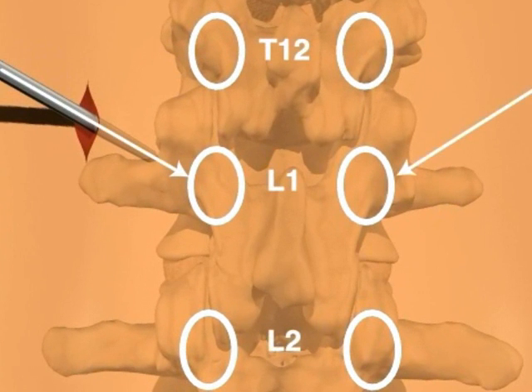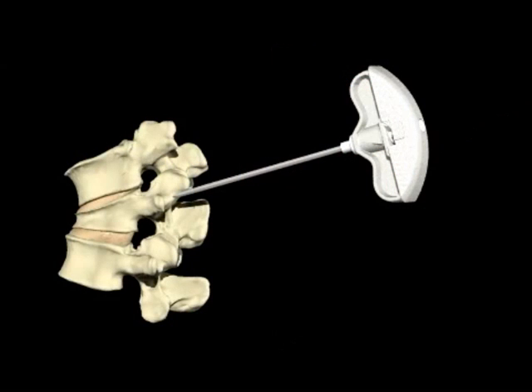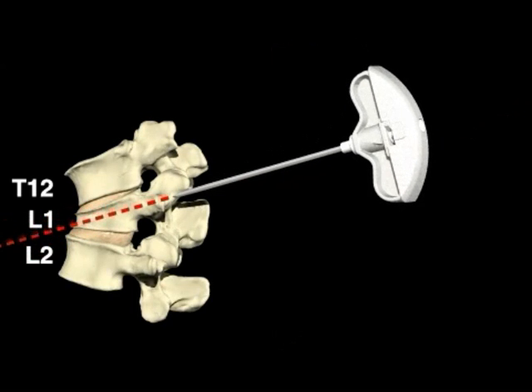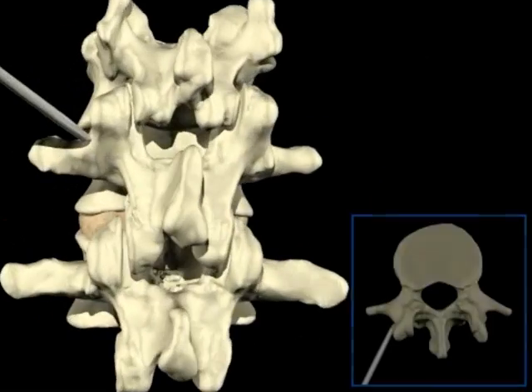In the AP view, use the 11-gauge bone access needle to start at approximately the 10 o'clock or 2 o'clock position on the lateral border of the pedicle. The exact starting location will vary with fracture configuration and pedicle morphology. Switch to a lateral view to verify needle trajectory and position relative to the superior and inferior pedicle margins. Return to the AP view.